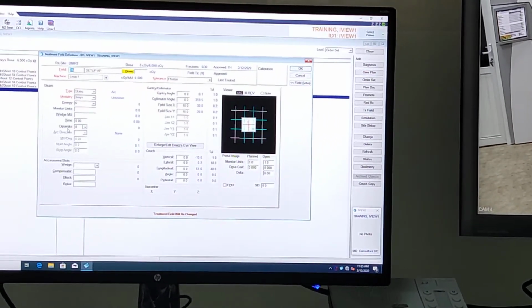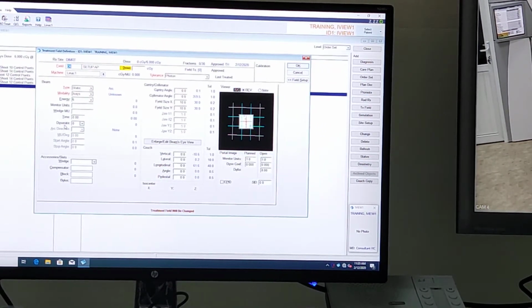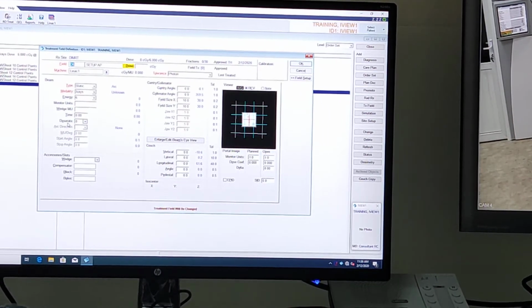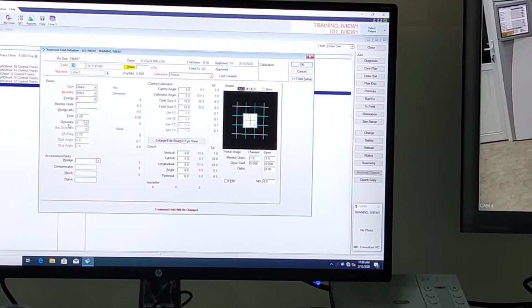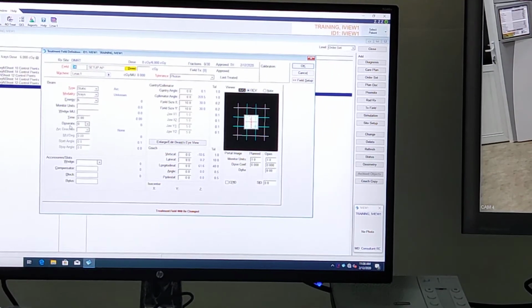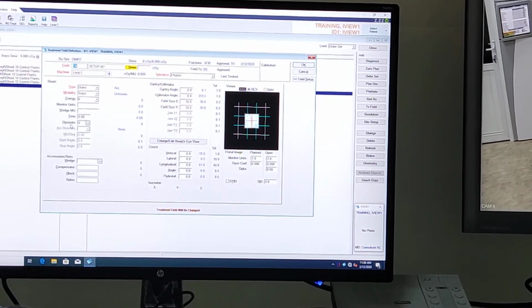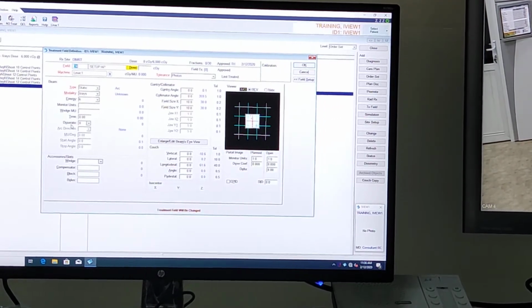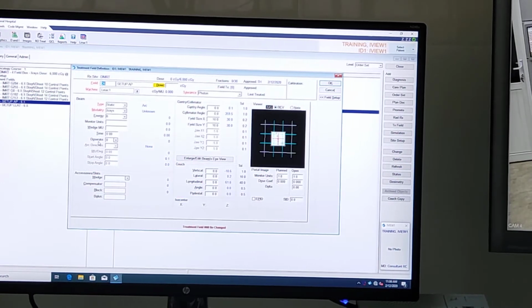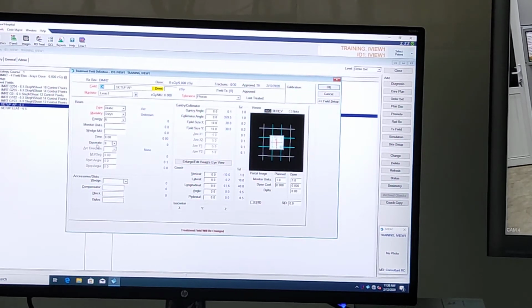Okay. So one warning, when we put the delta, we always keep in mind ALARA. Do you remember ALARA? As low as reasonably achievable. So it means whenever we expose open field, we expose patient to higher dose. We expose more organs to radiation. So delta, if we put very large delta, we overexpose the patient. So we keep delta as small as possible, just enough to see the anatomy of the patient.